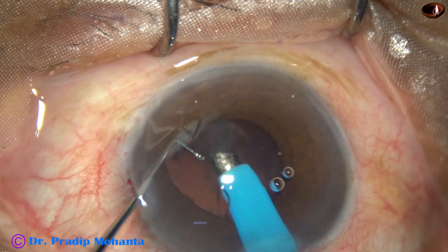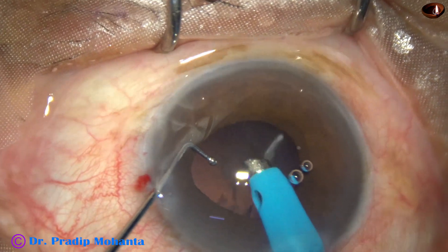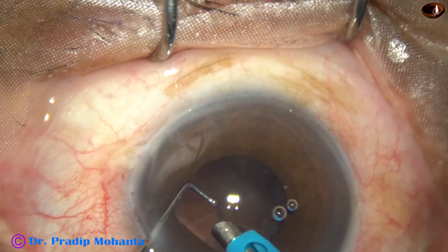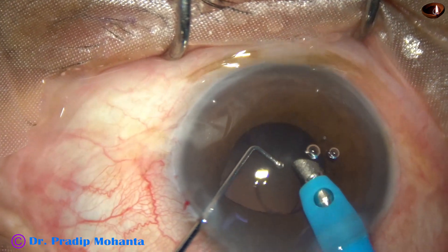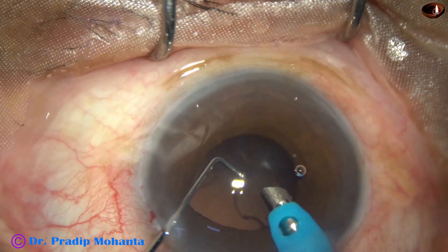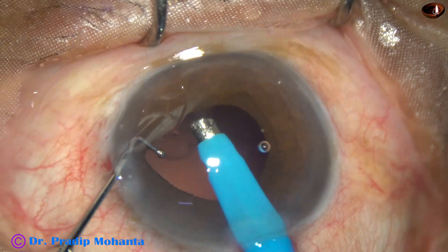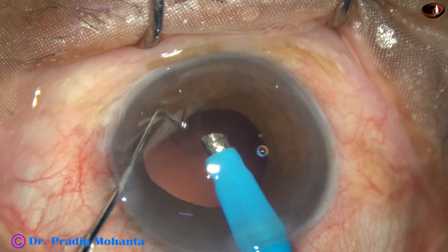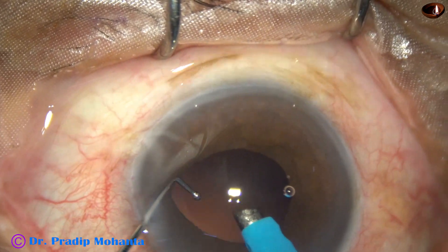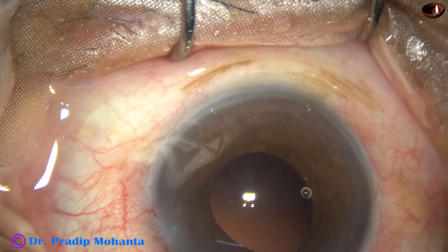The nucleus is managed. I do not stop here — with the help of this phaco needle, I try to remove some cortex. I find it was easy to remove the cortex with this handpiece itself. I could remove all the cortex except a small speck at 5 o'clock. As I try to remove that, I caught the pupillary margin. Immediately I released it, and there is no iris damage at that point.